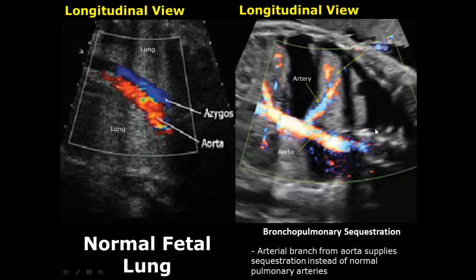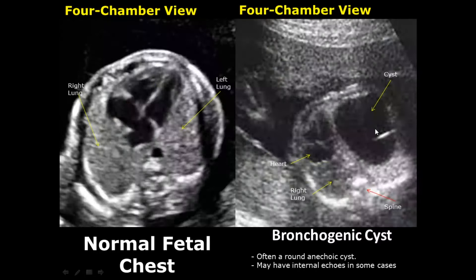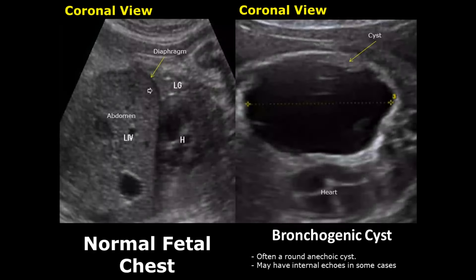A bronchogenic cyst is a lung cyst which appears as an anechoic cyst and may have internal echoes. If it is large enough, it may cause a mediastinal shift. Here is a large bronchogenic cyst in the coronal view causing mediastinal shift.